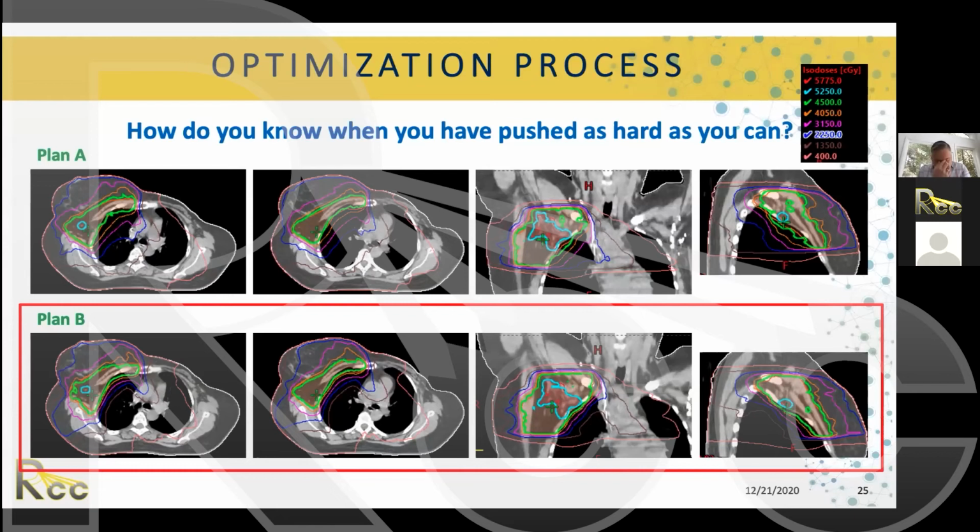One thing with ALARA, or the best coverage you can do, and I think you have talks about this: make sure that, now that we're conforming the doses so tightly to the PTV, this goes hand in hand with a good immobilization system and a good image guidance system during treatment. Why? I'm sure you learned that with IMRT, where the isodoses are much more conformal to 3D, you need to make sure that the patient is positioned correctly, and that we are accounting for every organ motion, or in this case, breathing motion. I'm sure you have had classes and sessions on that. So that's very important too.